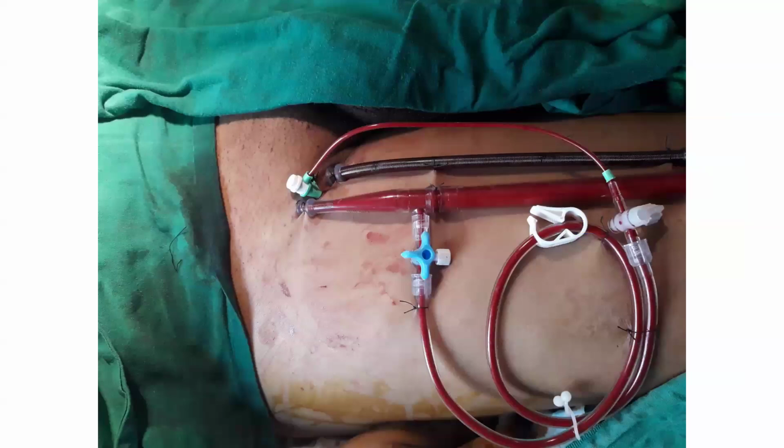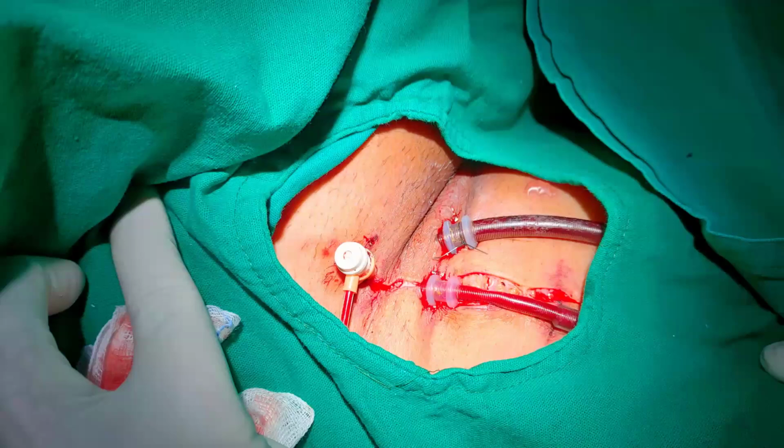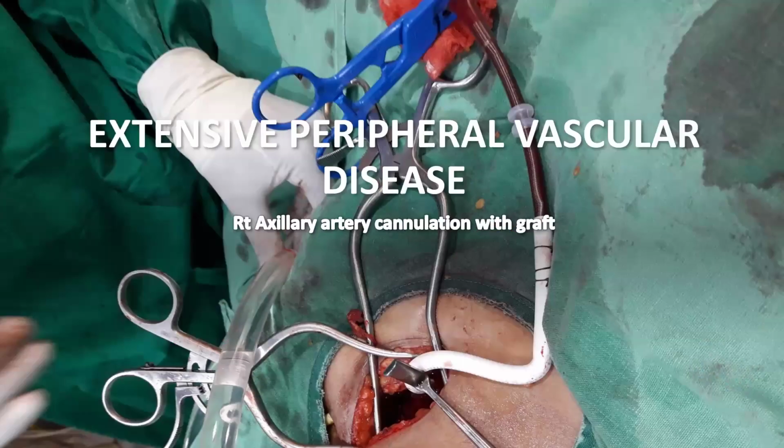It can also be surgical, where surgeons usually dissect the arteries and veins and put in the cannulas under direct vision. And sometimes if the femoral artery is very diseased, then how are you going to do it? In that case, we can cannulate the right axillary artery, but we cannot put a cannula directly in it. We usually put a graft into the side, and to that we connect the cannula. And this is the central cannulation.